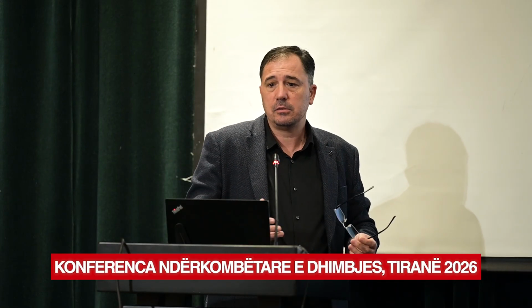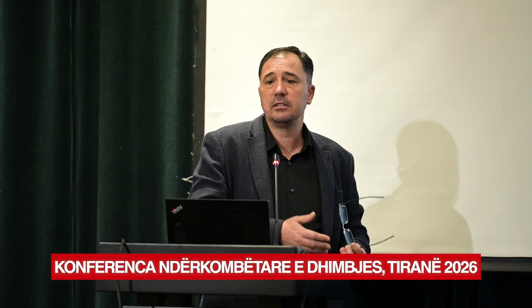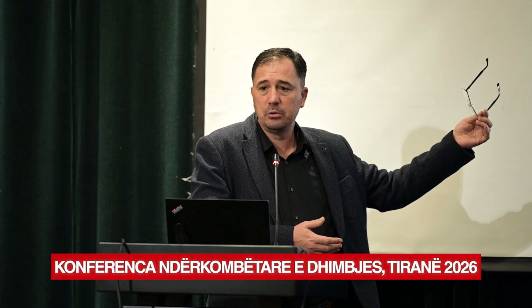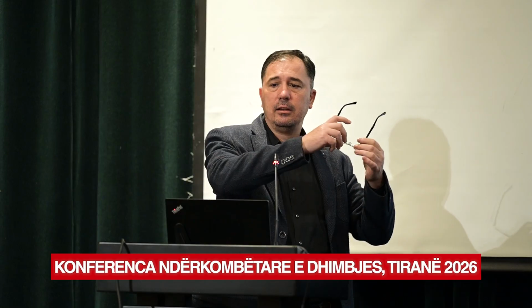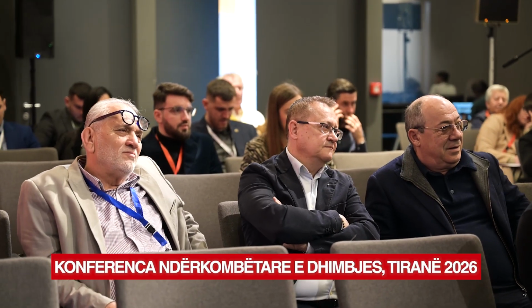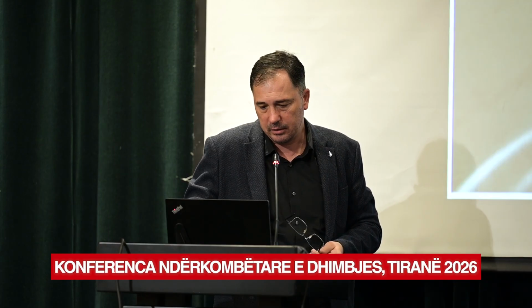If a surgery was previously done, like in this case, when the CT scan is giving a lot of artifacts, we can use the conventional X-ray machine and we have some markers, like a schema of a dog, that show us where to inject the corticoids, to also help relieve a little bit of the pain.